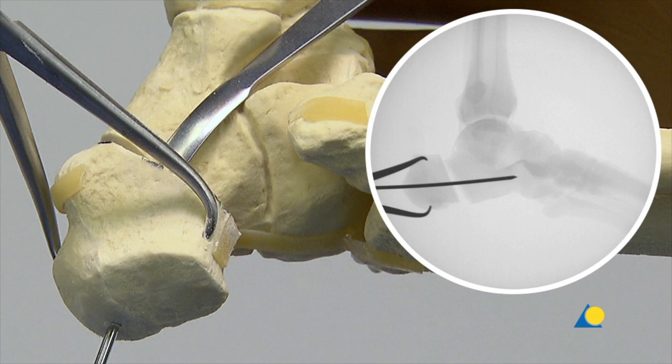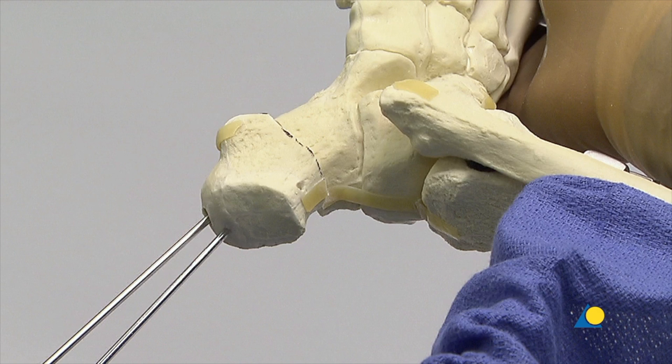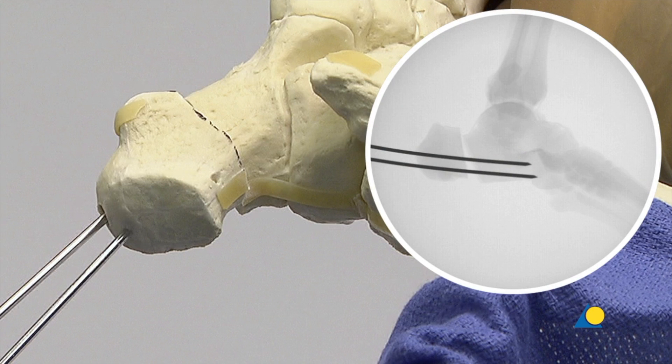Image intensification is used to evaluate the insertion depth of the guide wire. Two points of fixation are needed to avoid rotation of the tuber fragment, so a second guide wire is inserted parallel to the first.